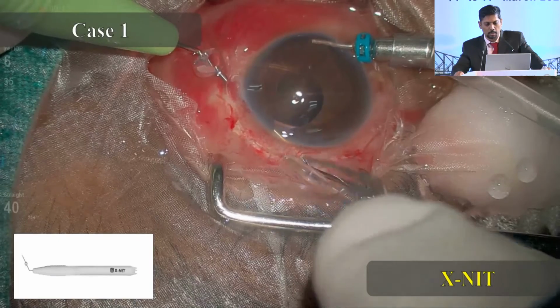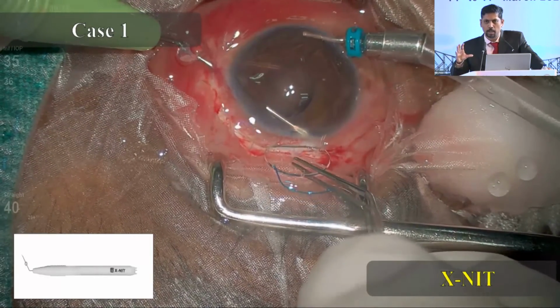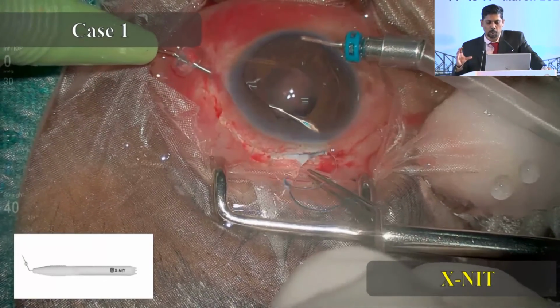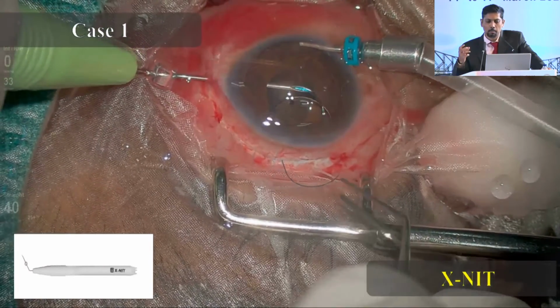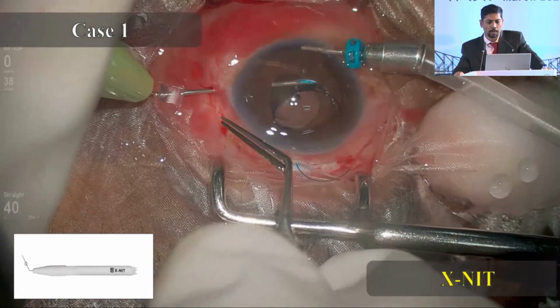Once you are good, try to retract the needle. At the same time, push the IOL inside. It should go as one unit. Retract, at the same time push it. You should not be retracting and pushing the IOL separately. That's when probably the haptic-optic junction will become weaker, that you don't want to happen.